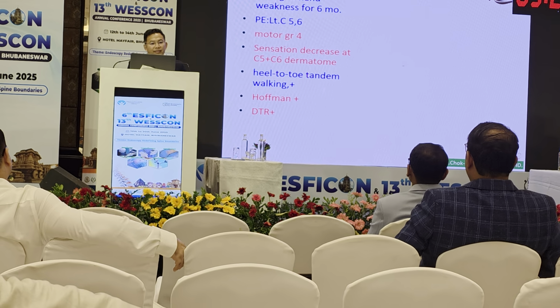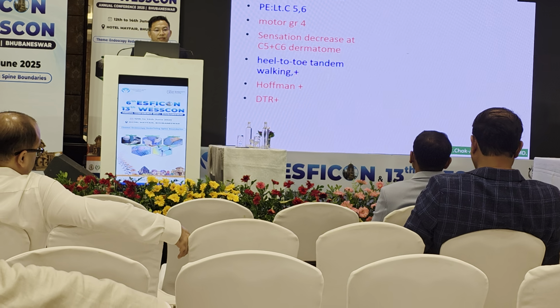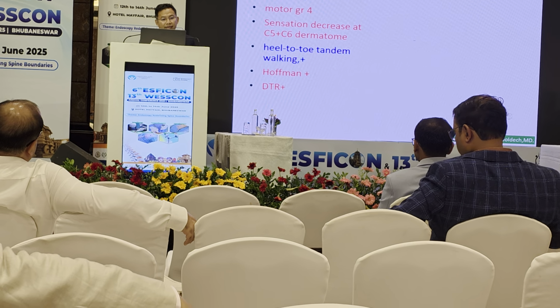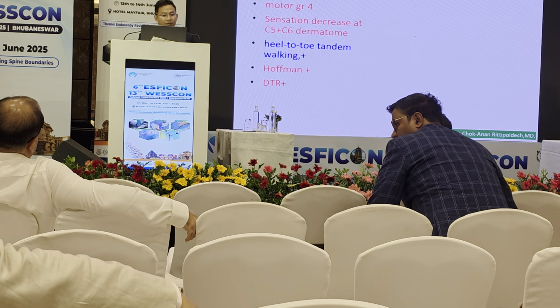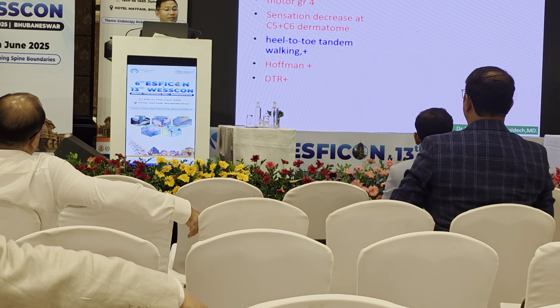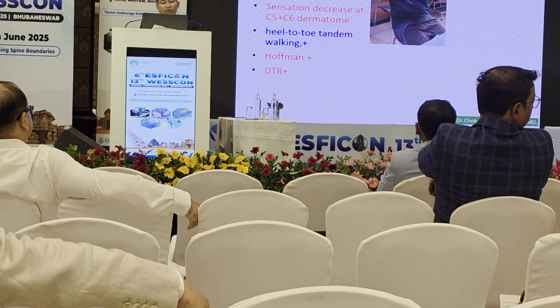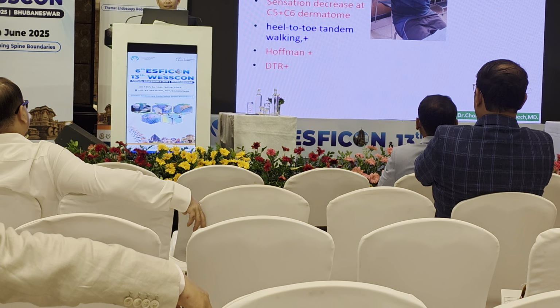This is my case. A 45-year-old Thai male. He had a spastic cord for a long time, around 6 months.